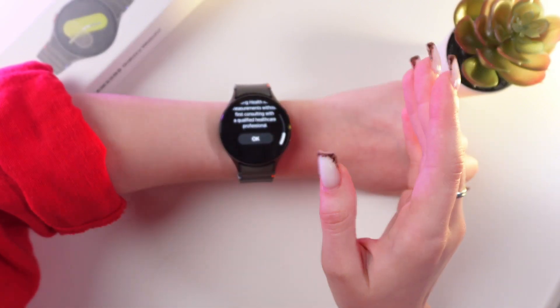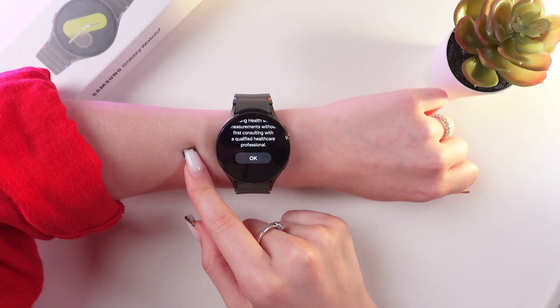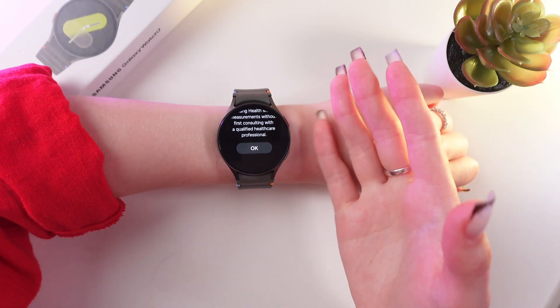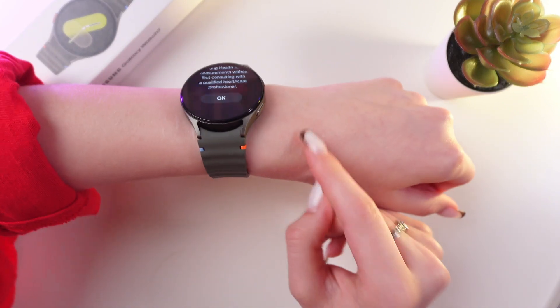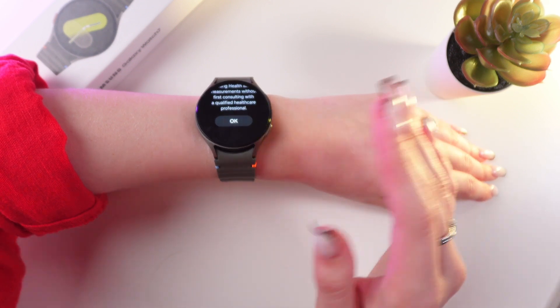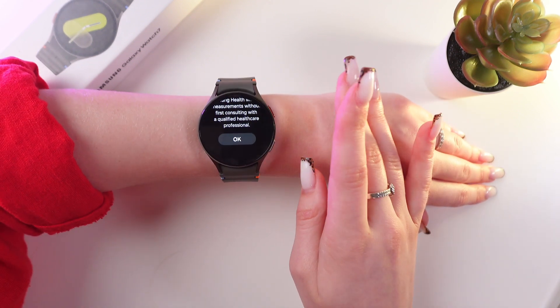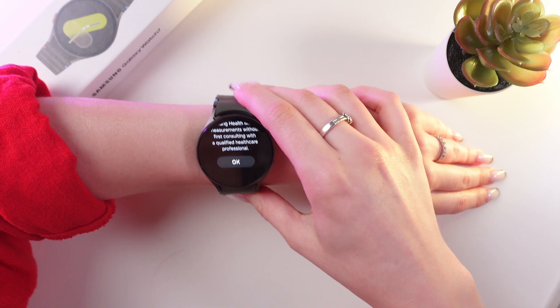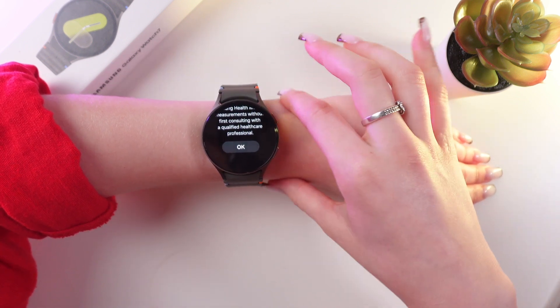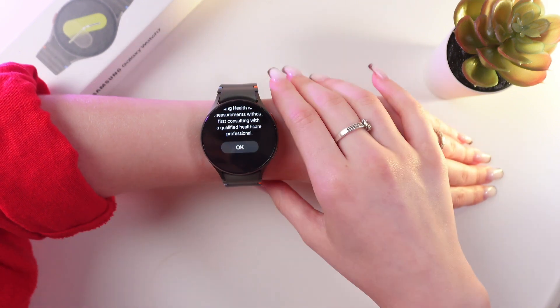Now, most importantly, make sure that the watch is snug on your left wrist and that it is 2-3 inches, which is 5-7 centimeters above the wrist bone. This will help make the measurement as accurate as possible. Also make sure that the watch is not resting directly on the wrist bone, as if the watch is too close to this bone, the results may not be accurate.